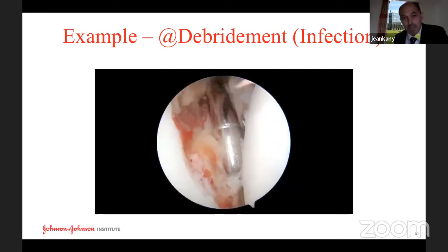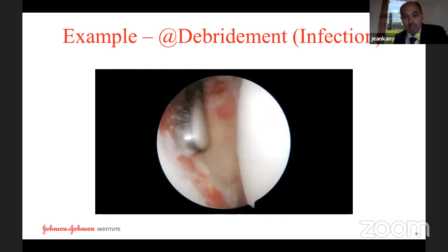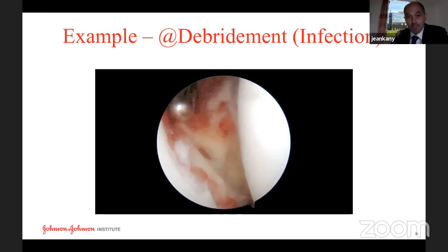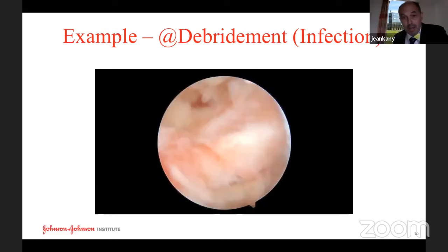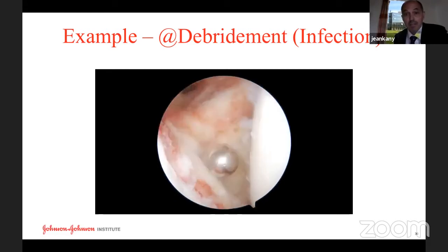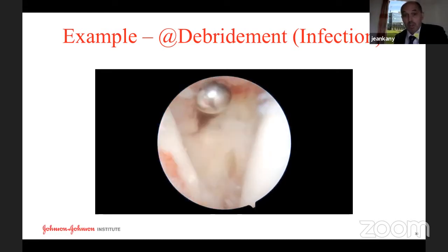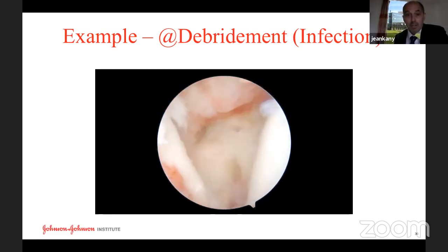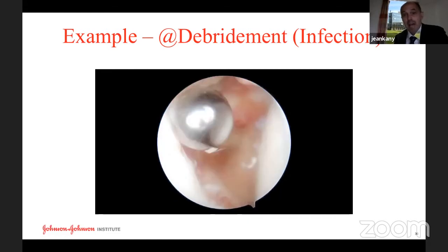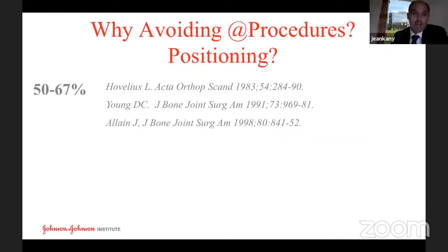You can see this soft tissue. I did not need any additional Bankart procedure, but you can see that there is some capsule onto the bone block. The bone block is fine. So if you make the drainage very quickly, you don't have osteolysis, so you don't have any problem. This is a key to remember. If you have any infection, do not wait, because you may have a high complication like osteolysis.